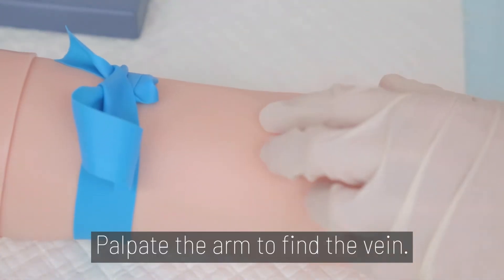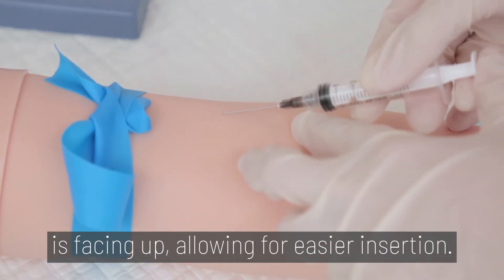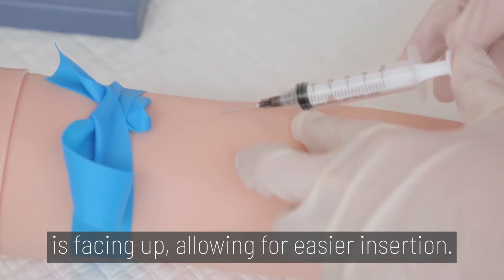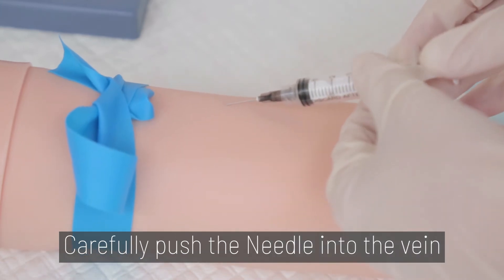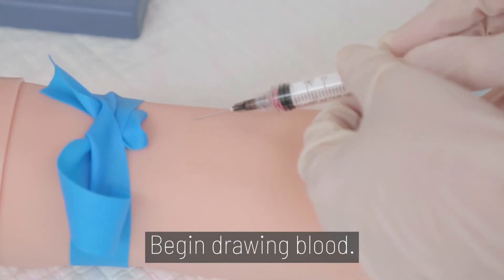Step 3: how to palpate the arm to find the vein. Make sure the hollow tip of the needle is facing up, allowing for easier insertion. Carefully push the needle into the vein until it is inserted about halfway. Begin drawing blood.